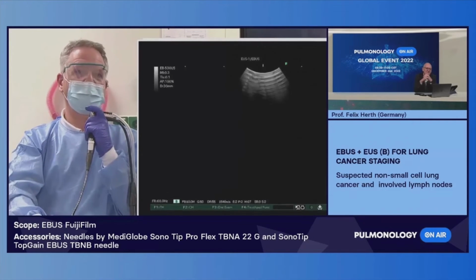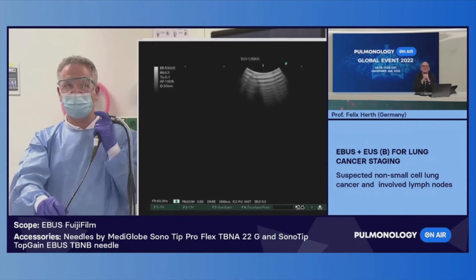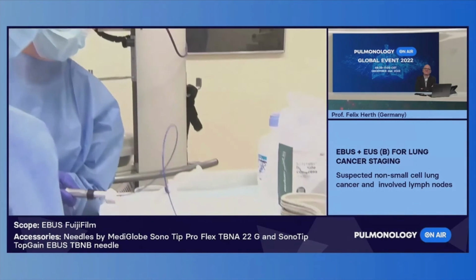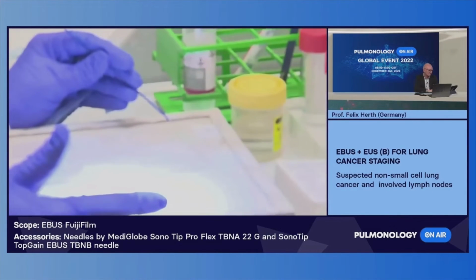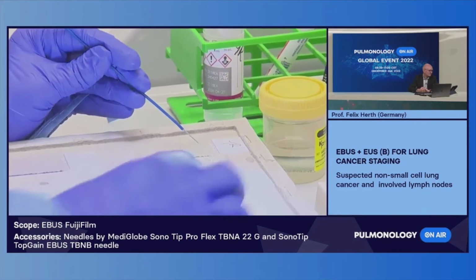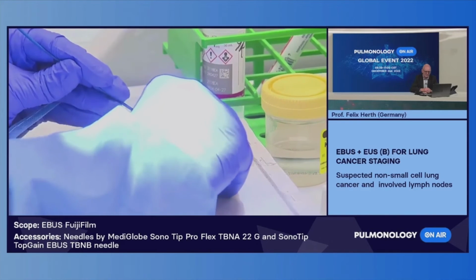Yeah, Jouke, the audience is observing you carefully. The big question came directly, why you don't suck on the needle?